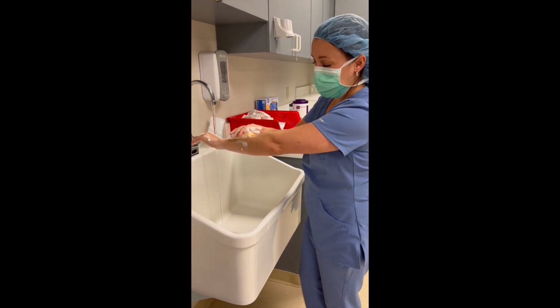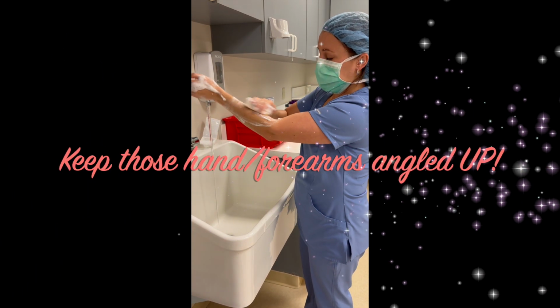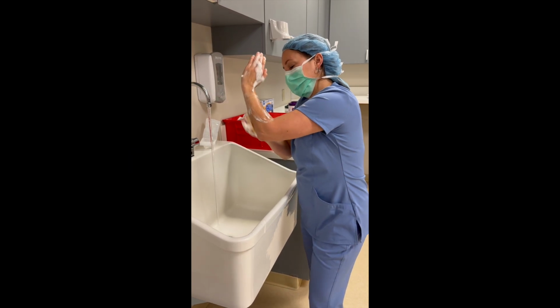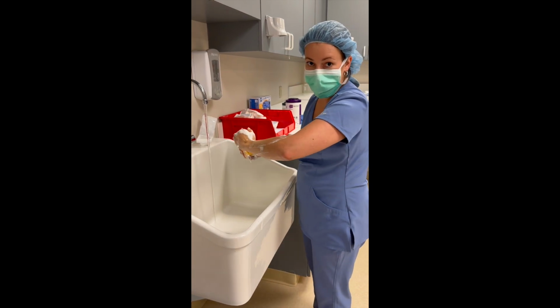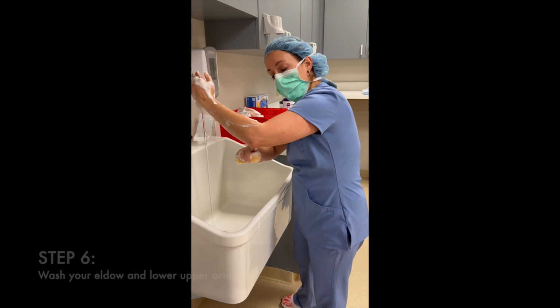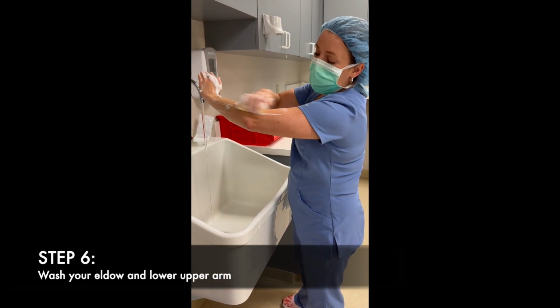Now I'm going to come back and do right here. It's okay to wet this again. If it dries out, just wet it. No big deal. So now I'm about to focus on my elbow into my upper arm, okay? I'm going to keep my arms up because, again, I don't want to put my arms down and this roll back down and recontaminate where I just scrubbed, okay?